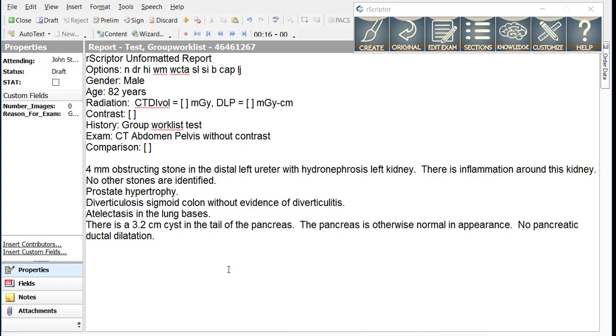The first keyword is impression new. With impression new, we tell R-Scripter that we want all text before this keyword to go into the findings section and all text after this keyword to go into the impression.